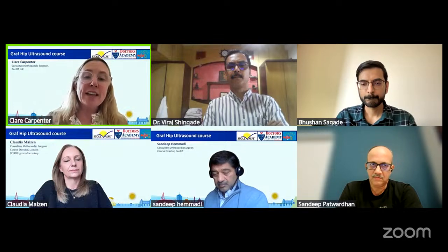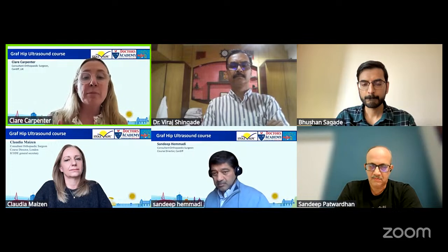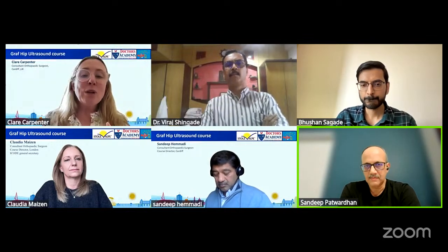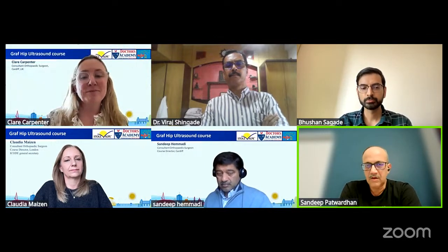For hips that are clinically stable, but we know they have risk factors for hip dysplasia, they come at 6 weeks. Because we don't see any point, if it's clinically unstable, to wait till 6 weeks. Yes. Okay. All right. I think we'll come to the other questions later.